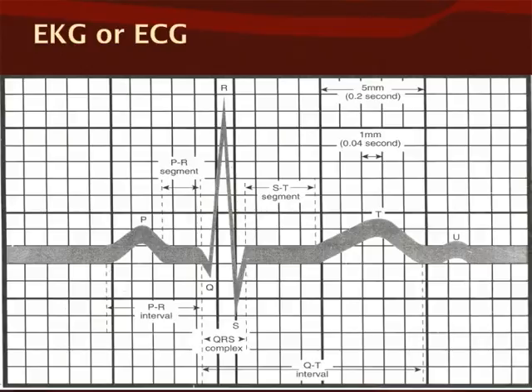We're just looking to compare what normal sinus rhythm looks like compared to life-threatening rhythms, and whether or not it's an atrial rhythm or it's a ventricular rhythm. An atrial rhythm will have a P wave. A ventricular rhythm will not have a P wave. A ventricular rhythm is not going to be a normal ECG, because I've just explained to you that we want the impulse to begin at the SA node. So we need to have a P wave. And sometimes some patterns don't.